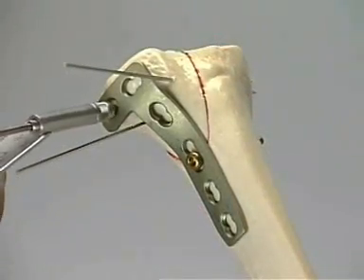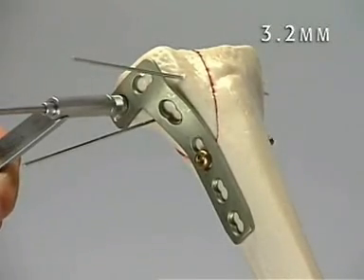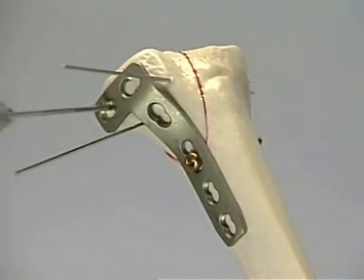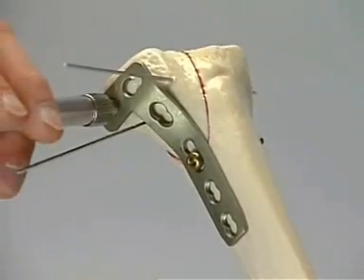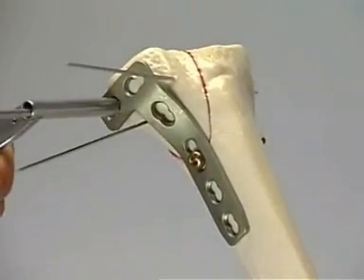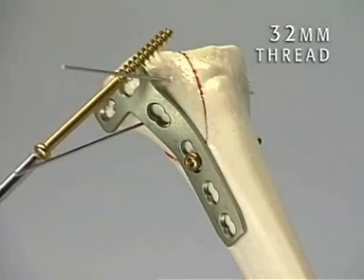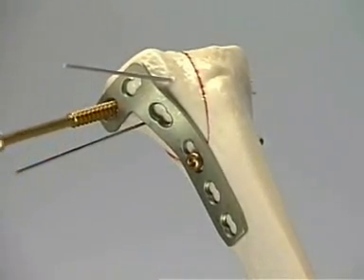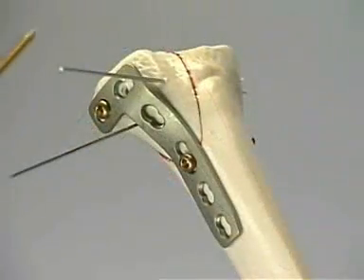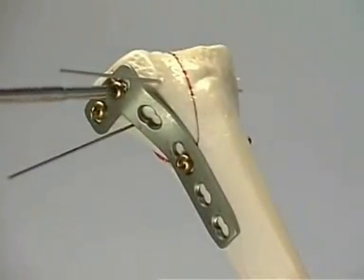The plate is fixed to the bone with the fracture split wedge fragment. A 6.5 millimeter cancellous bone screw can be inserted either through the plate or independent of it. It is important that the lag screw be placed where it will provide the best compression of the articular fragments. In this case, the cancellous screw is inserted through the plate. After drilling with the 3.2 millimeter drill bit and measurement of the depth, the near cortex is tapped. A cancellous screw with a 32 millimeter long thread is inserted. For a screw to act as a lag screw, the thread must not cross the fracture line. The second cancellous screw is inserted and the screws are tightened alternately.